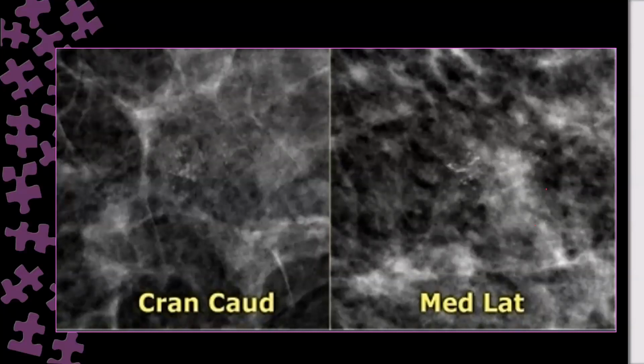This is what we call amorphous type. You cannot tell exactly what is the shape, what is the margin, it is hazy, it is fuzzy. It's what we call amorphous type of classification.